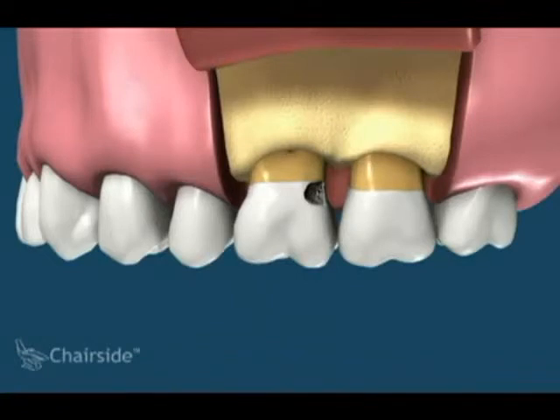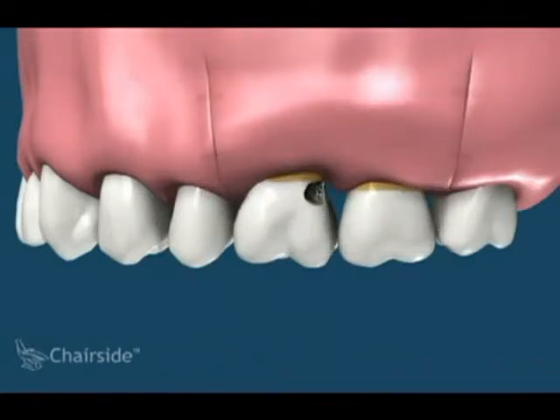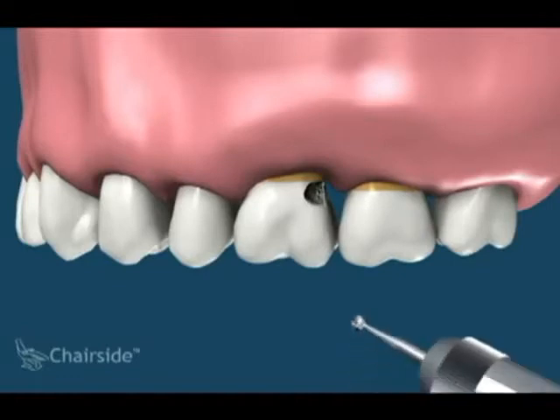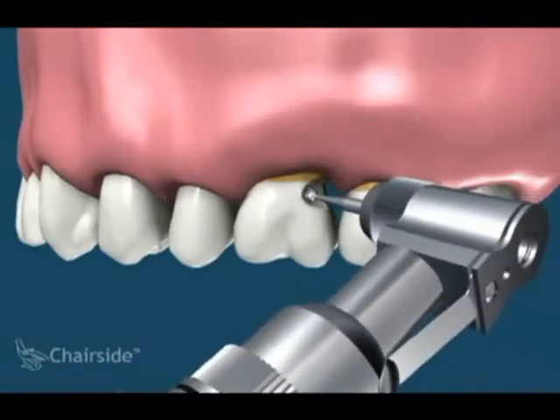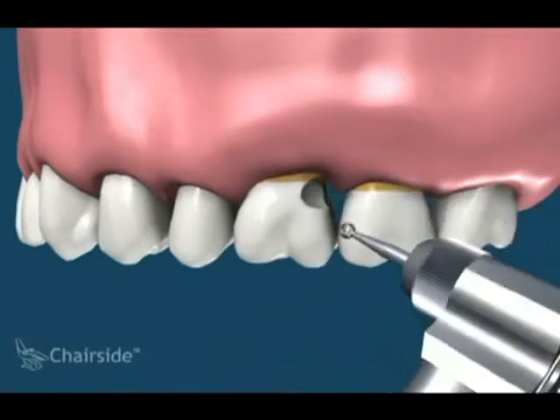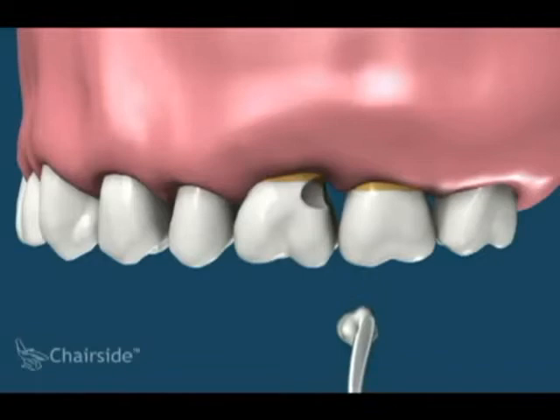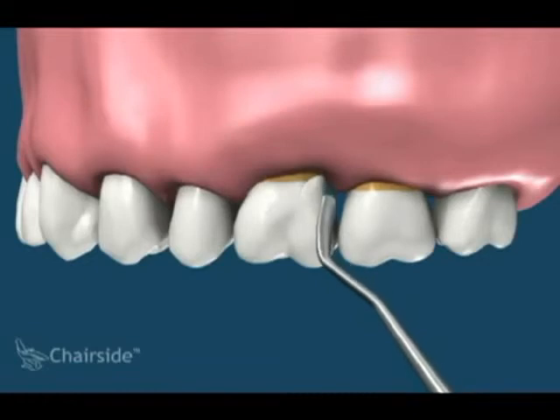The gums are then repositioned on the prepared bone, which now supports the gums below the cavity. The cavity can now be accessed. In this situation, a resin filling is used to restore the cavity. The cavity is accessible and removed, followed by the resin placement. The reason the procedure is called crown lengthening is because the crown tends to look longer after the procedure.